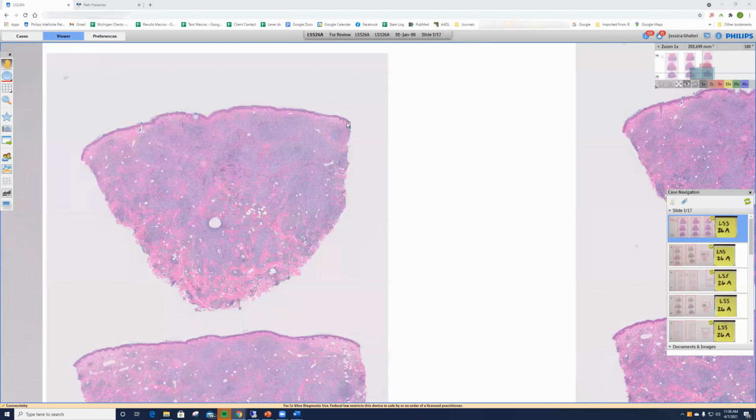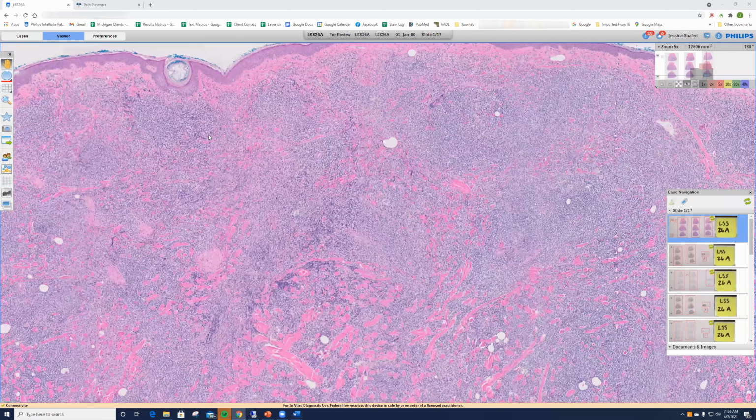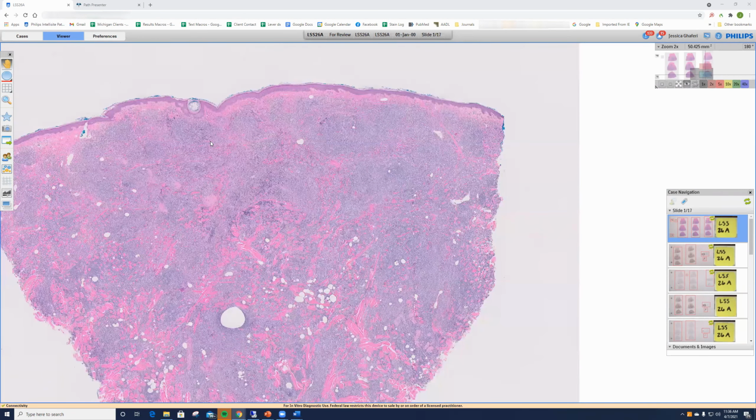All right, so the next case I'll be sharing from the family of the B-cell lymphomas is a marginal zone lymphoma, and the older name for this is an immunocytoma. And this is the next most common of the lymphomas, also a B-cell lymphoma, also a lymphoma with an excellent prognosis. And these lymphomas are indolent lymphomas.